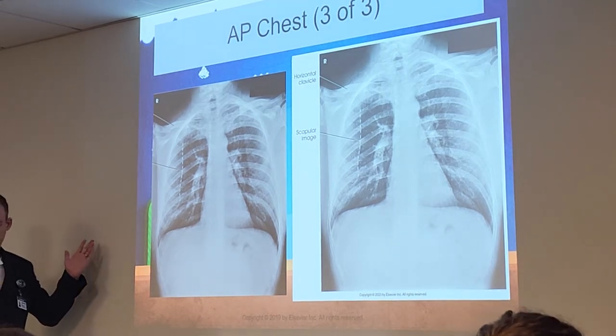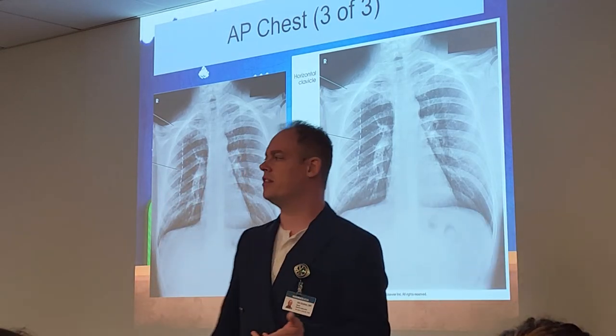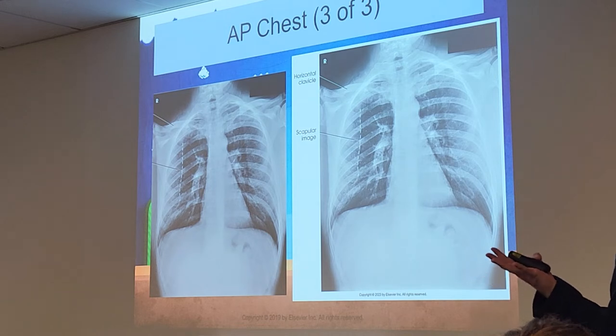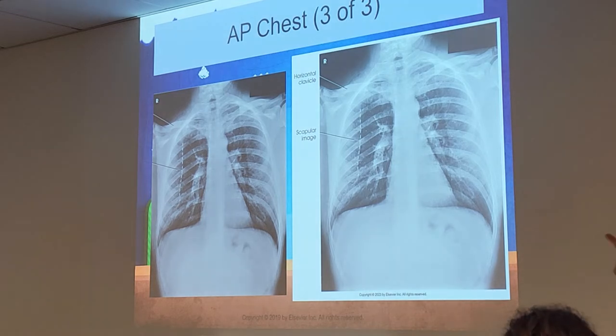Now, when it comes to labeling these, another thing to keep note of, general rule in radiography is if the image does not have AP on there, you typically will assume a PA, because most of the time you're supposed to actually label it as AP. Because even though they give you these indications of a horizontal shape, a clavicle, close to the apices, they're actually very, very close in the way they look. It's almost impossible to distinguish the two if you have two high quality radiographs. So once again, if it's not marked as AP on an image, you assume PA chest. I would write that down. It's very important to remember. If it's not labeled as an AP, you're going to go ahead and assume it's a PA chest, unless it's indicated.